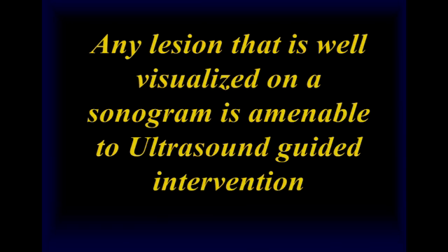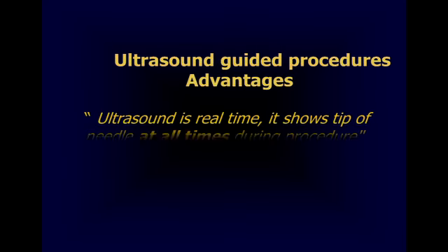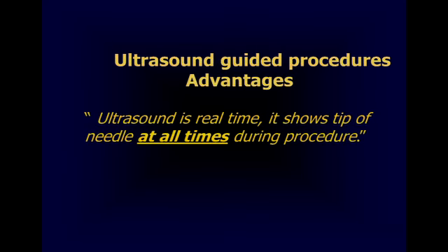So again, to summarize, any lesion that is well visualized on a sonogram is amenable to ultrasound guided intervention. Ultrasound is a real-time technique, and it shows the tip of the needle at all times during the procedure, and therefore it is extremely safe and reliable.